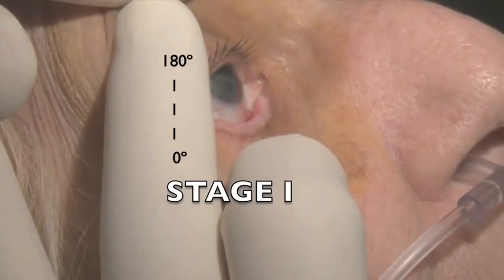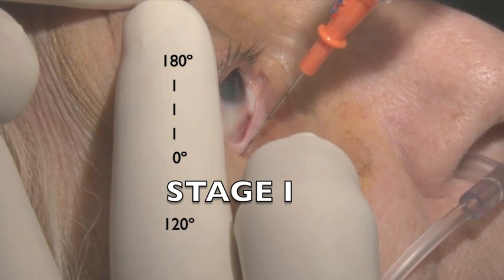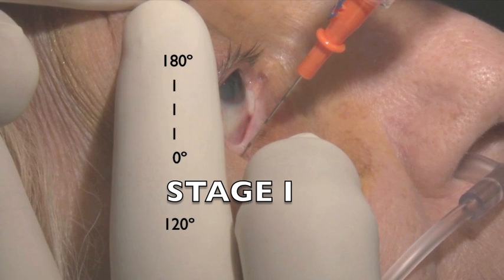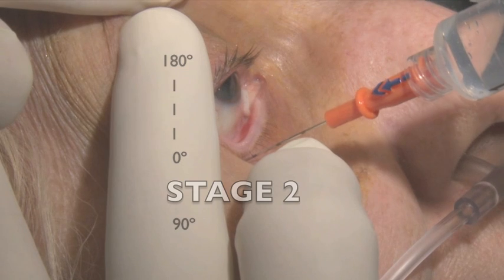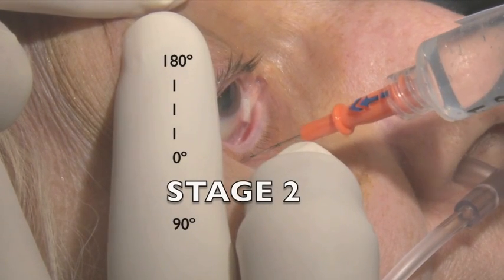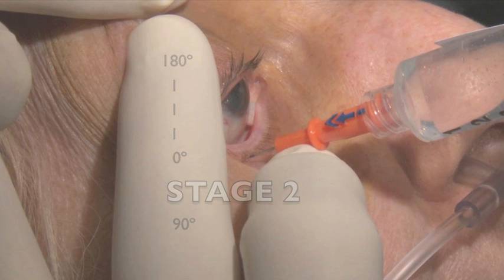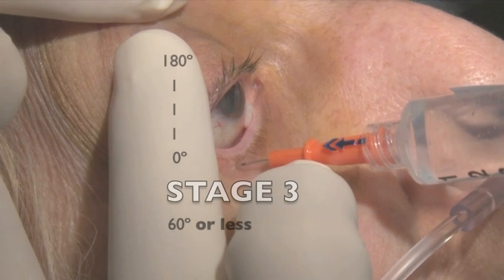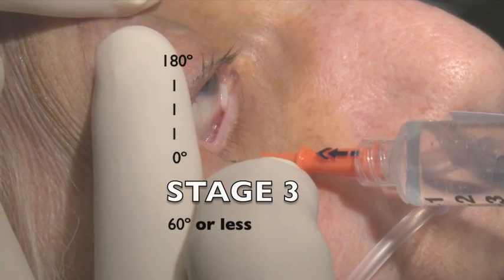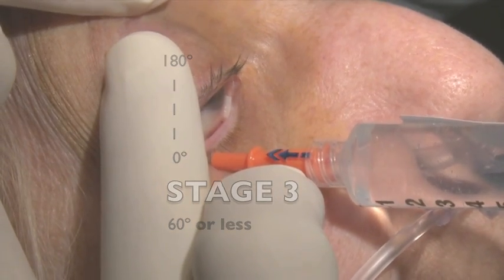Stage 1. Insert the needle tip with the bevel towards the globe 2 millimeters lateral to the limbus and 2 millimeters inferior to the globe at 120 degrees towards the orbital floor through the skin. Stage 2. Redirect 90 degrees and slowly advance the needle tip posterior, passing the calculated equatorial plane of the globe in the extraconal space. Stage 3. Rotate the needle tip cephalad until the shaft of the needle rests on the infraorbital rim, then slowly advance the needle tip into the intraconal space.